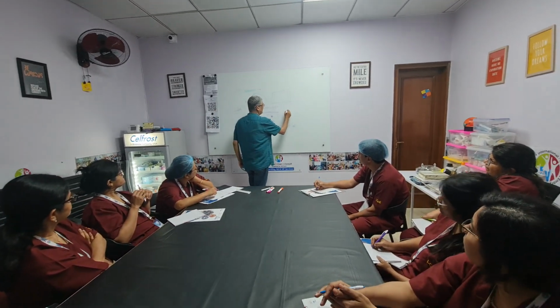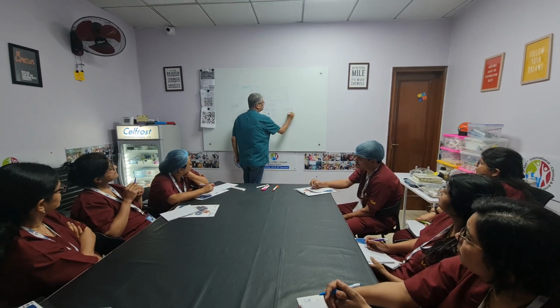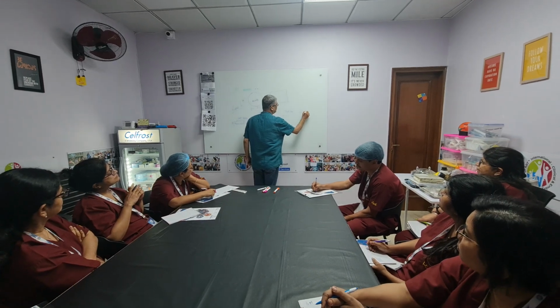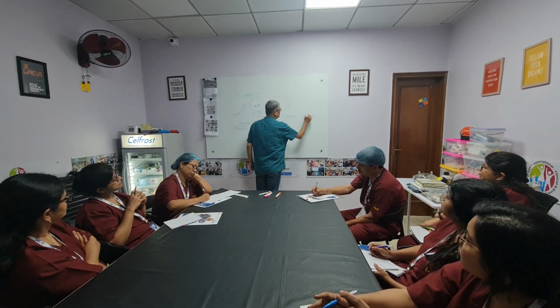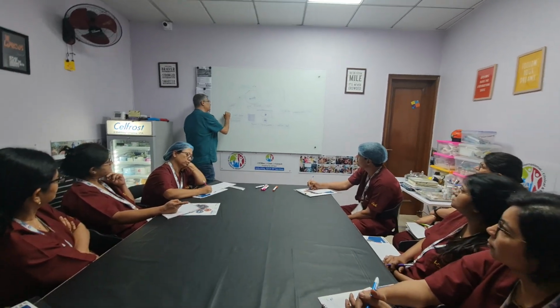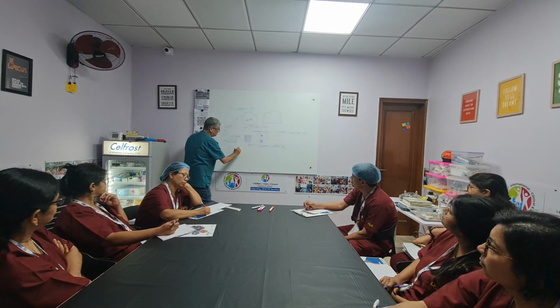Now we have many options, and they normally try to give you something like a Makler. Makler is a very good counting chamber, but costs around 65,000 INR. So don't buy this. It's very expensive, and you tend to break them very frequently. When we work on a sperm counting chamber, we never cross more than 20x magnification. Why?